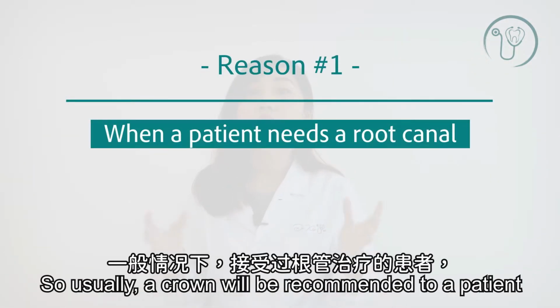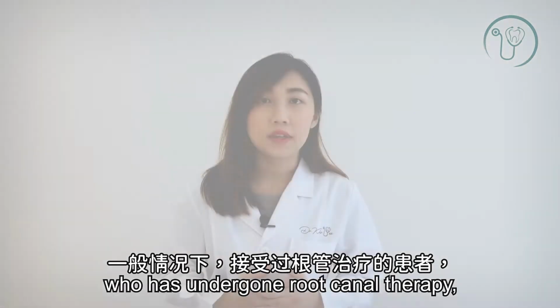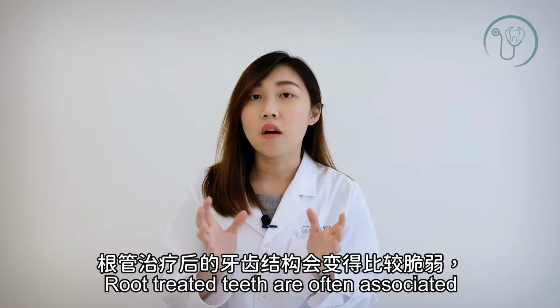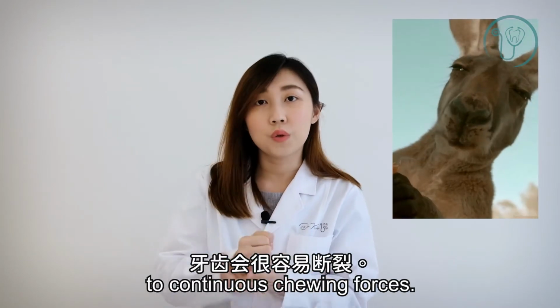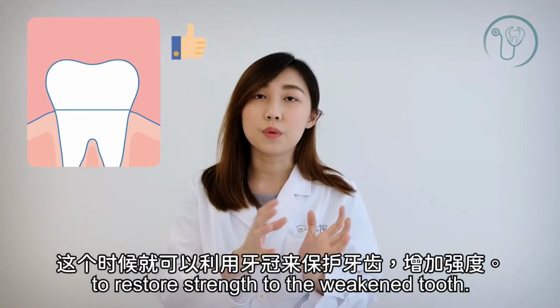So usually, a crown will be recommended to a patient who has undergone root canal therapy, especially at the back tooth region. A root-treated tooth is often associated with a weaker physical structure. Thus, it becomes less resistant to the continuous chewing forces. So a crown will then be utilized to restore the strength to the weakened tooth.